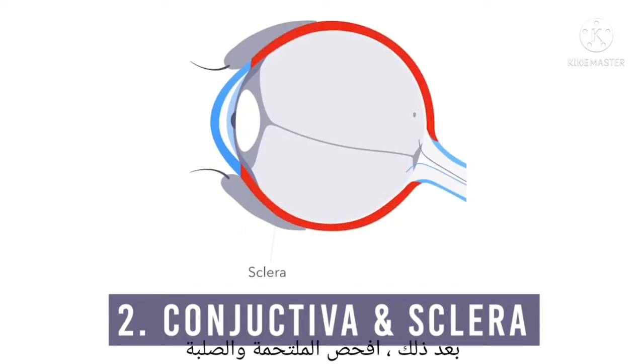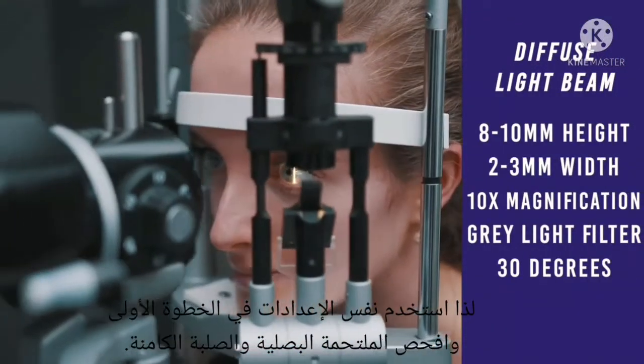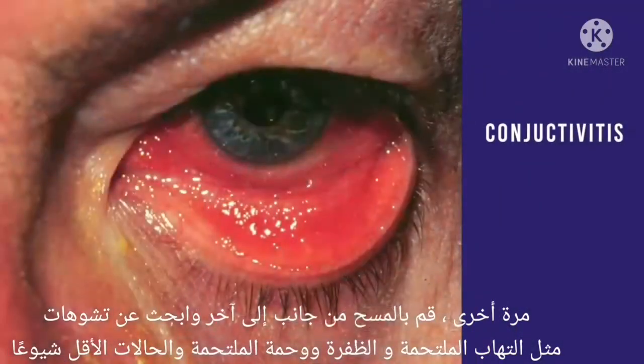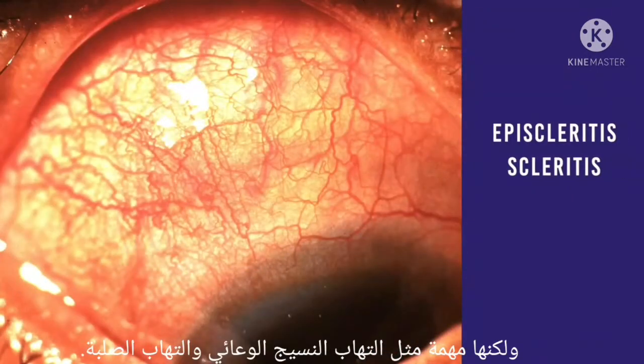Next, examine the conjunctiva and sclera. So use the same settings as step 1 and examine the bulbar conjunctiva and underlying sclera. Again, scan from side to side and look for abnormalities such as conjunctivitis, pterygiums and conjunctival nevi, and less common but important conditions such as episcleritis and scleritis.